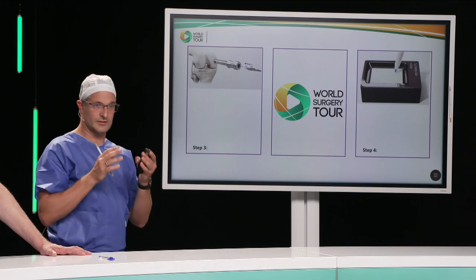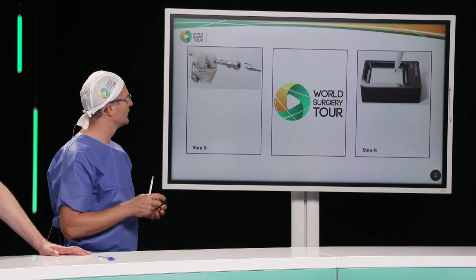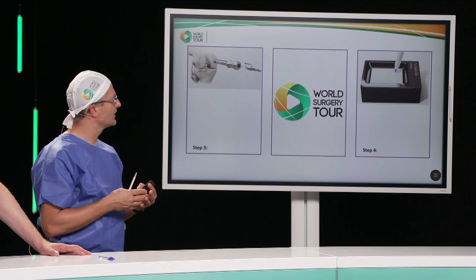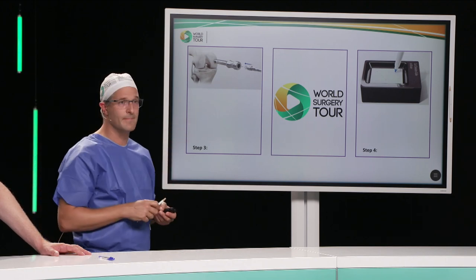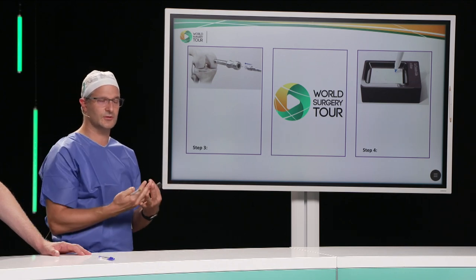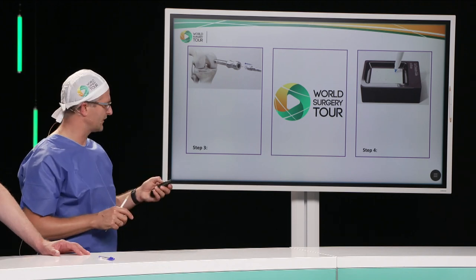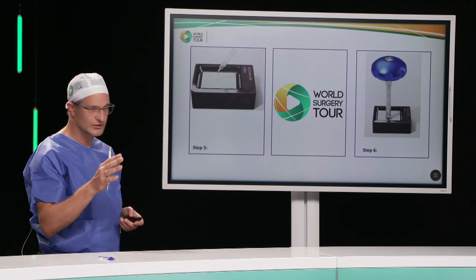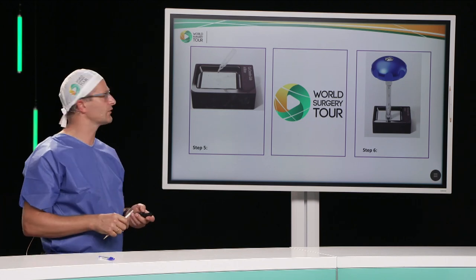Then this is the AMIC technique. Once you removed all the bad tissue from the subchondral bone, you're going to do a microperforation of the subchondral bone and then go on to now prepare the membrane, the cell-free membrane that will contain the cells that come from the subchondral bone and obviously going to protect the minced cartilage you apply to the defect. This membrane will be prepared in a certain fashion. You're going to see in a second. It will be matching the diameter of the defect.